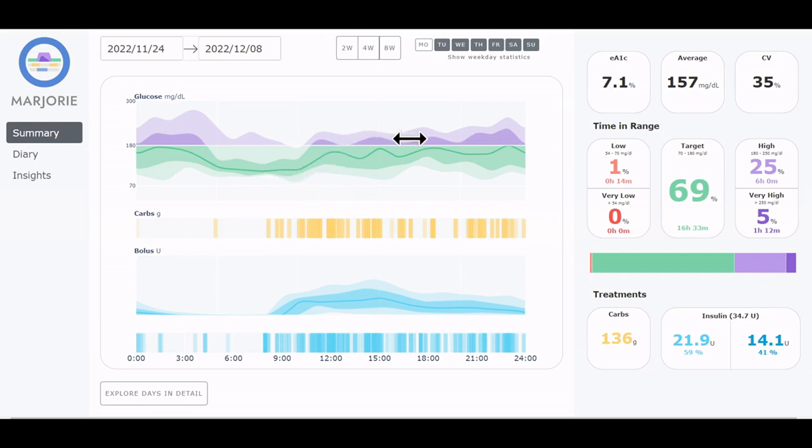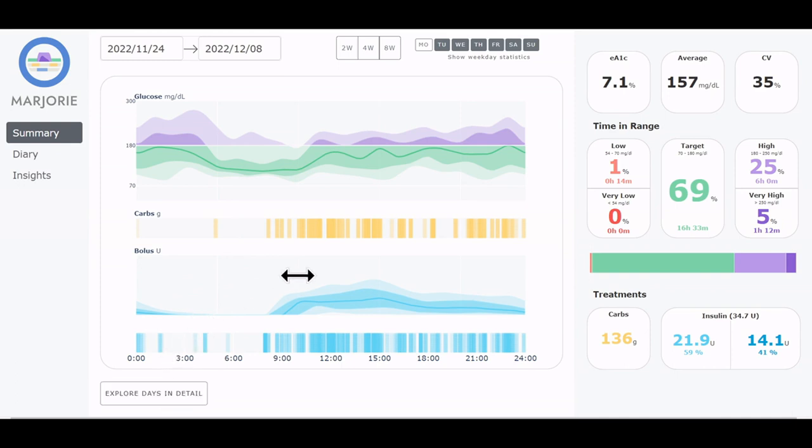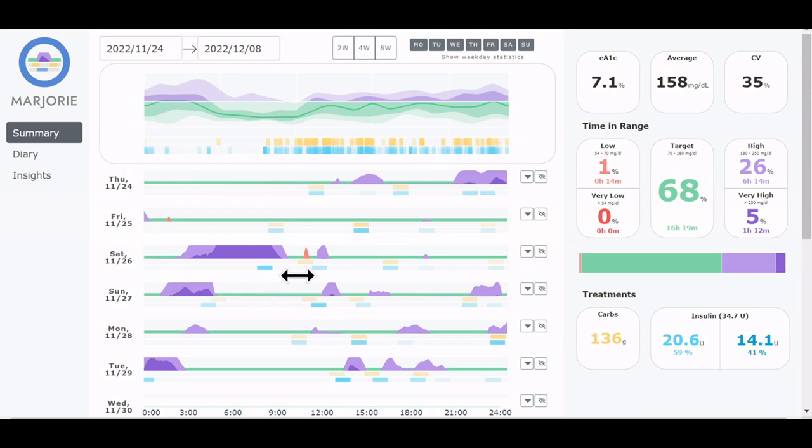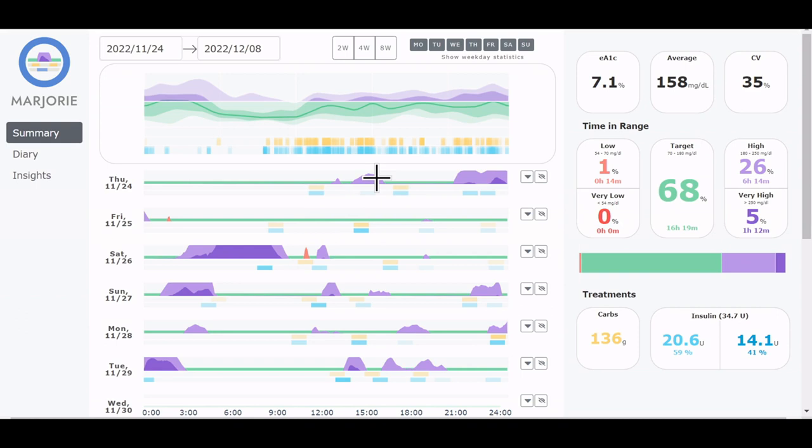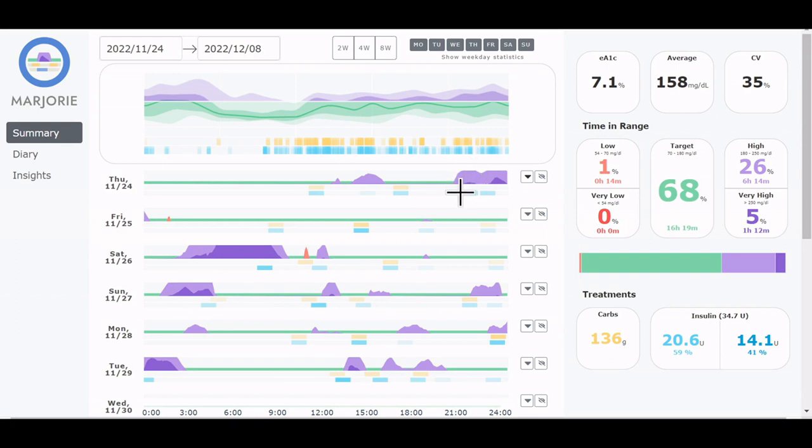We now want to explore the individual days in more detail. We here see an overview of the days that were aggregated for the profile above. The glucose is visualized by horizon graphs, so extreme values can be identified easily. And to see the detailed line plot, we can click on the expand button. Underneath, carbohydrates and insulin are presented in a heat map, where entries which occur within short time frames are summarized, here for example.